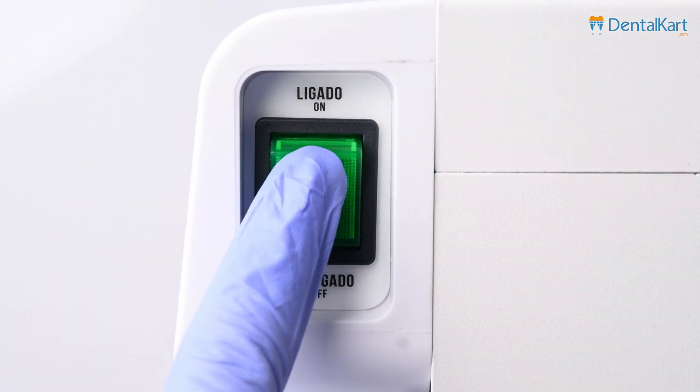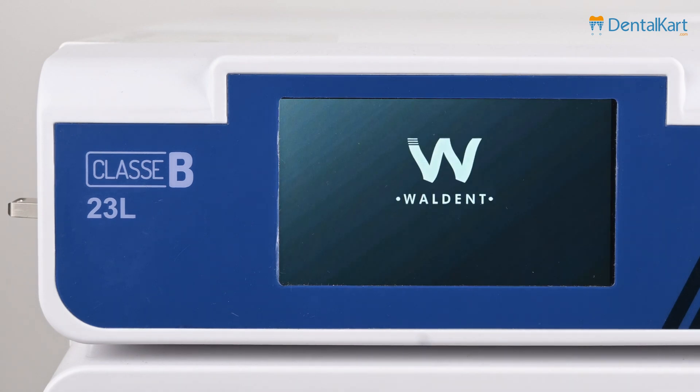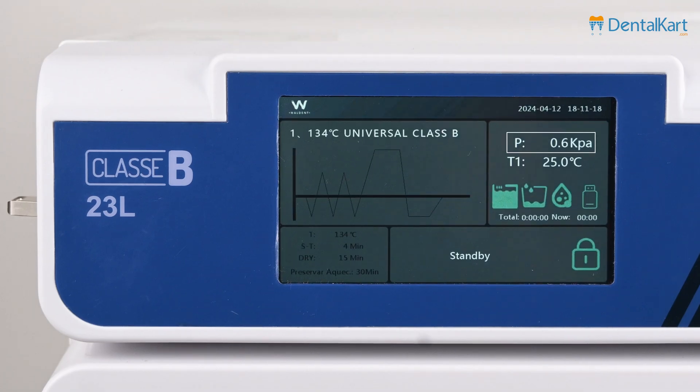By switching on the power button, the unit will enter into self-test mode, which takes around 10 seconds. If the pressure value is more than 10 kPa, perform pressure correction. If the pressure value shows around 0 kPa, we can proceed ahead.